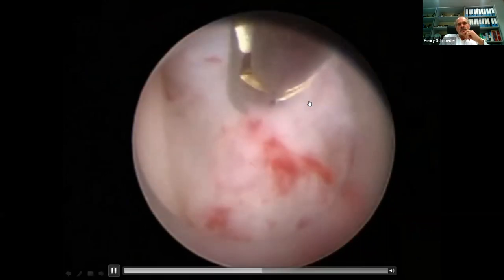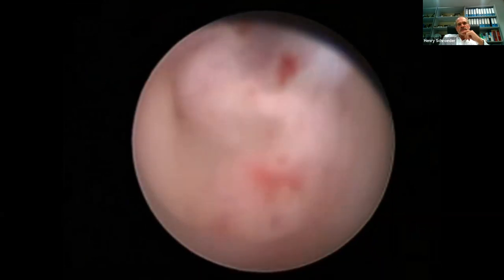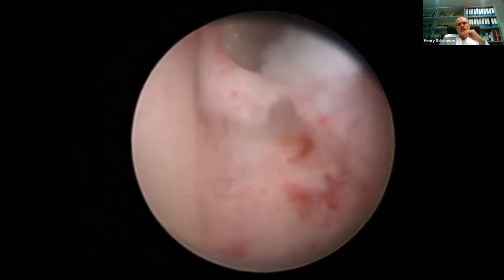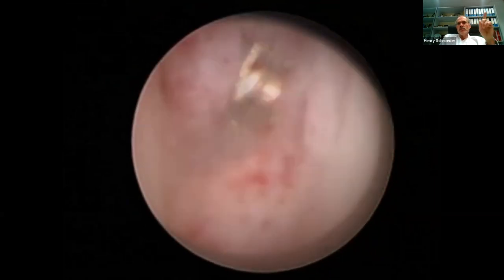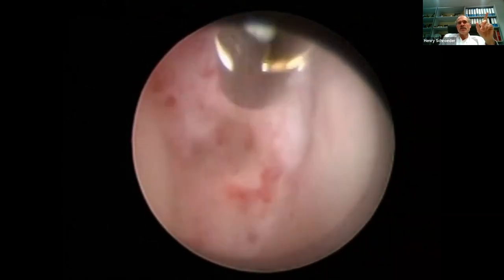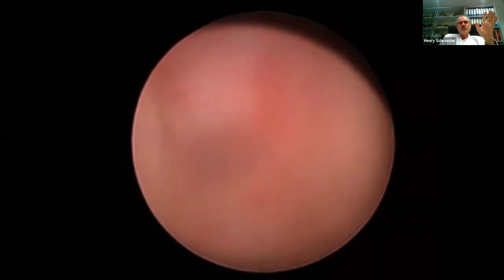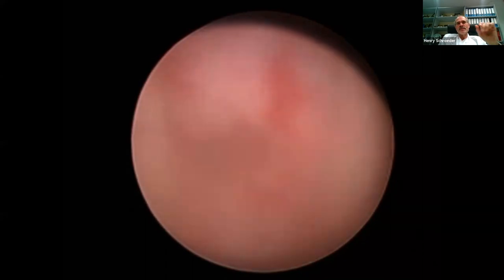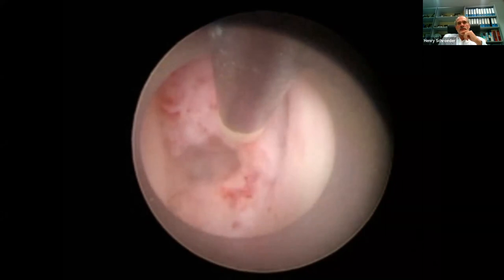You see, we take a biopsy from this lesion, just a little bit of hemorrhage. No coagulation. Before you take the biopsy, you should not coagulate, because the pathologist will see just necrosis or carbonization. So first we take the biopsy, even if it's bleeding, and then in the end, we make hemostasis to have a very good specimen for the pathologist.